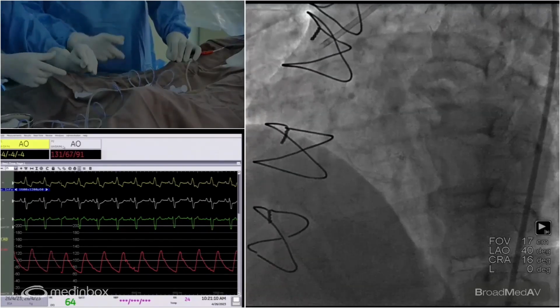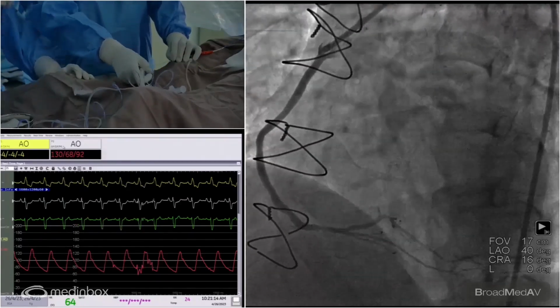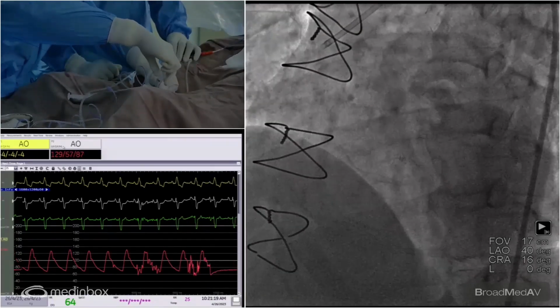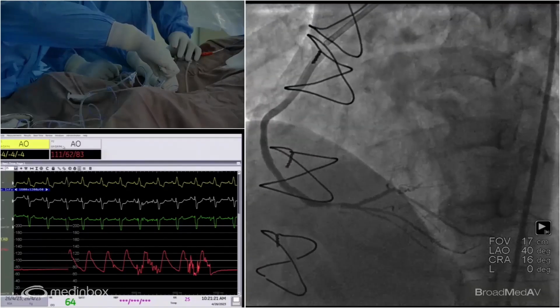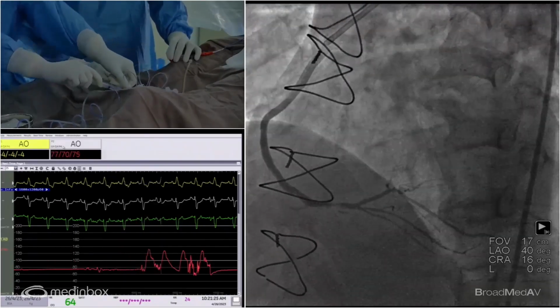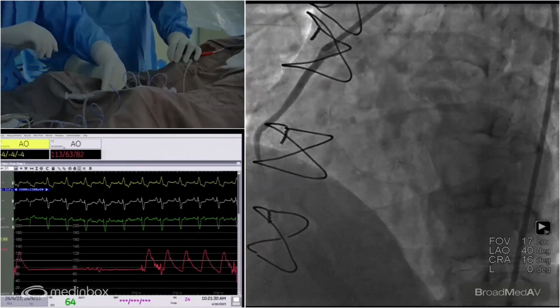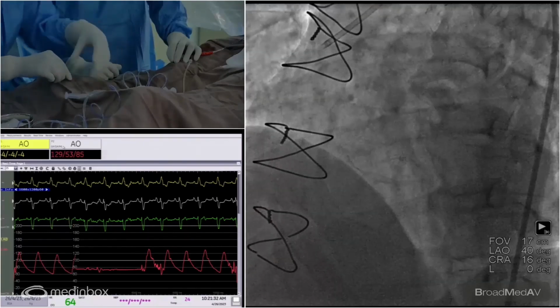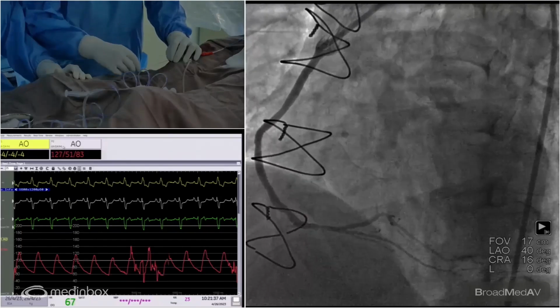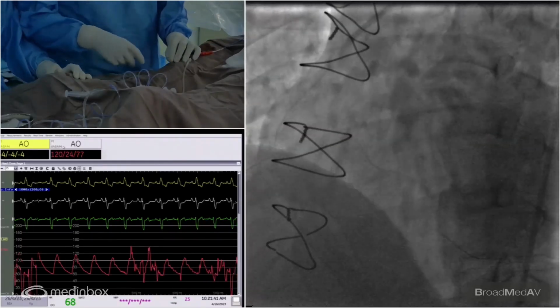Now the first thing before you balloon dilate a graft is to put some nitroglycerin down, because it's very important to prevent microcirculatory spasm and to improve flow that you give a good nitroglycerin. I sometimes ask, please load up some nicorandil in case we have some no reflow. So I keep nicorandil on the table. If in case I need some nicorandil, I will use it. Sister, yes, please load up some nicorandil. So sister has preempted that. She has loaded up the nicorandil.